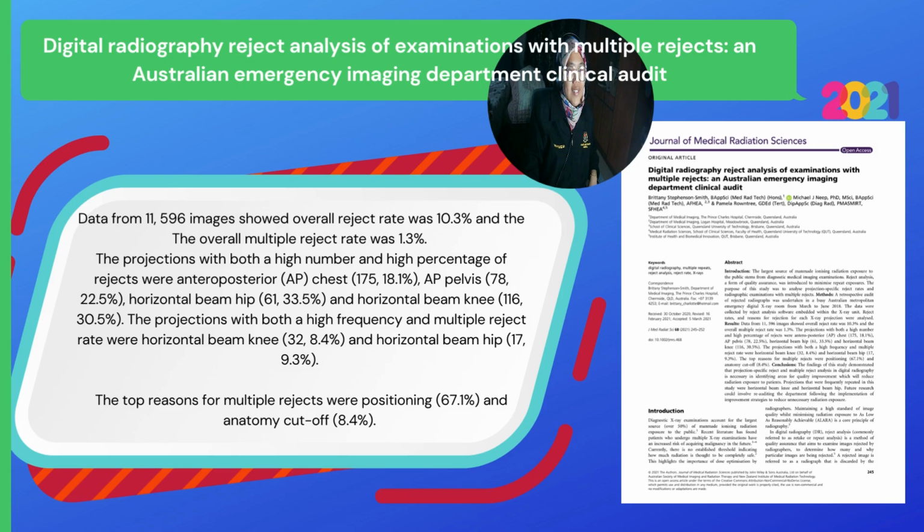Okay, this is another study from last year, 2021. Digital radiography reject analysis of examinations with multiple rejects in an Australian emergency imaging department clinical audit. So in this study, from 11,596 images, the overall reject rate was 10.3%, and the overall multiple reject rate was 1.3%.